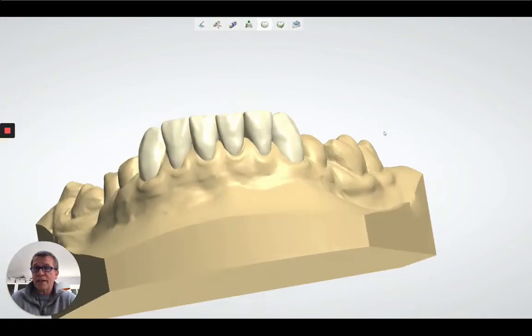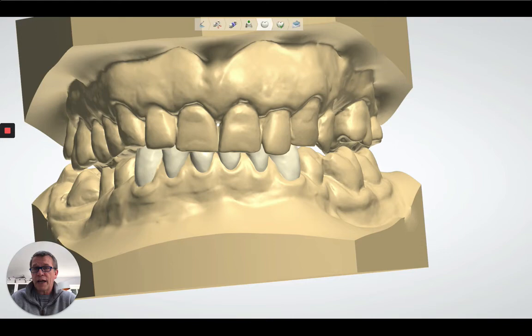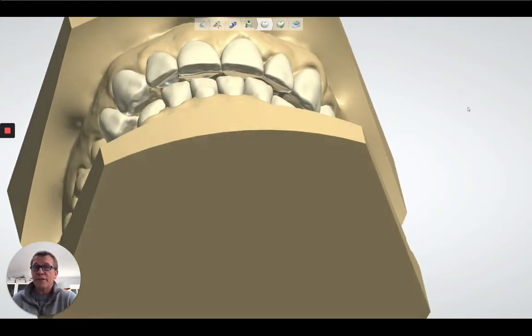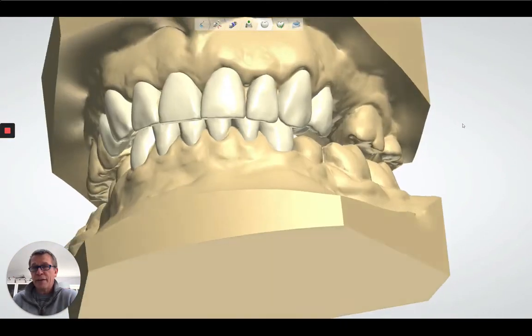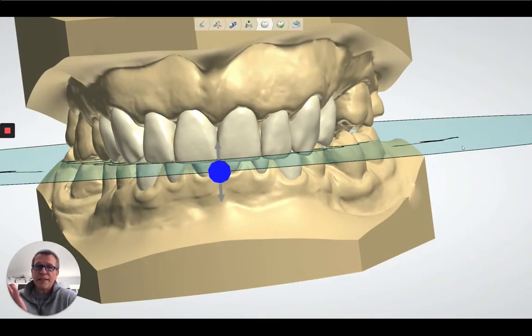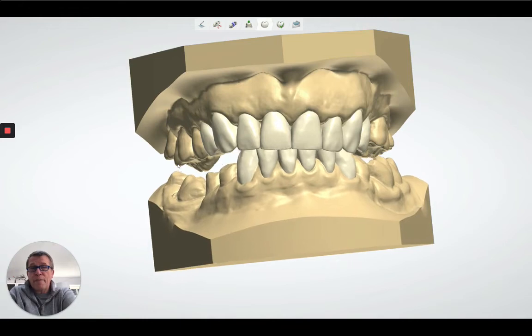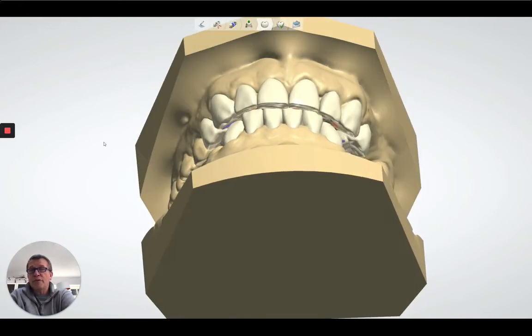The cool thing about this, the other thing with digital, is I can get on a call with him, or I can tell him next time, say, you know what, Shemek, I was looking to actually cover the lingual surface a little bit because I want to grab that enamel, so maybe we could do that. Maybe we're going to look at covering the palatal surface a little bit. And we can either change that now, or remembering that this is just a basic guide for us, we could maybe change it when we come to the full mock-up.